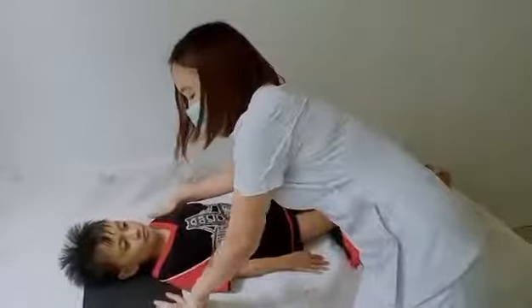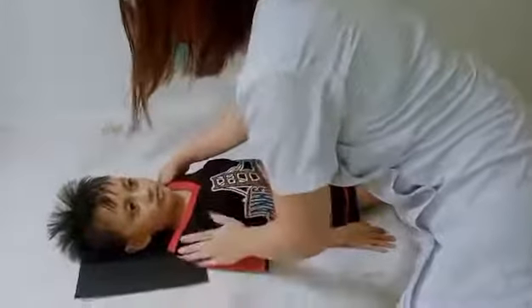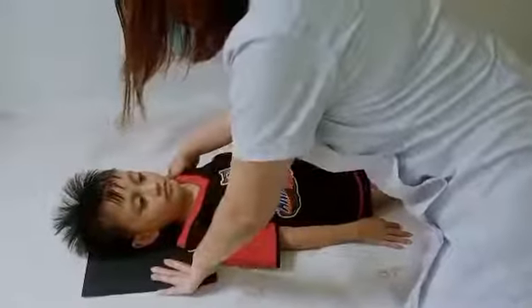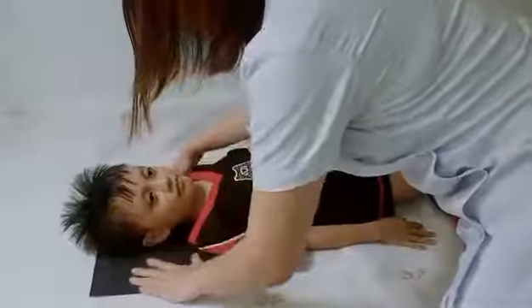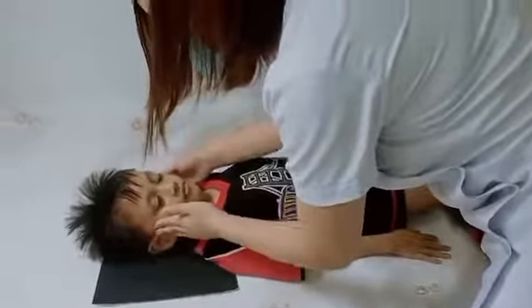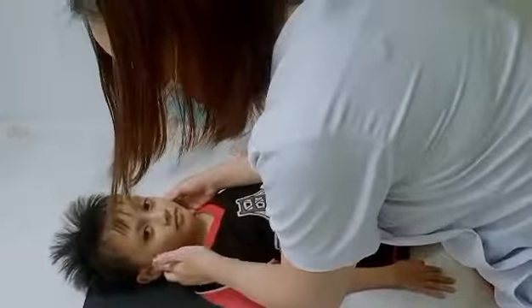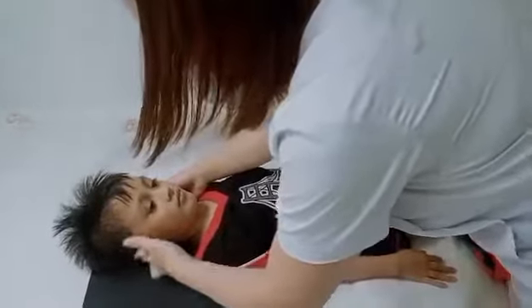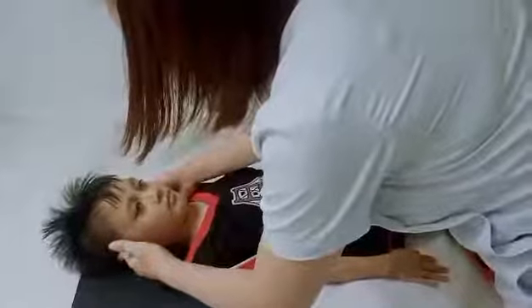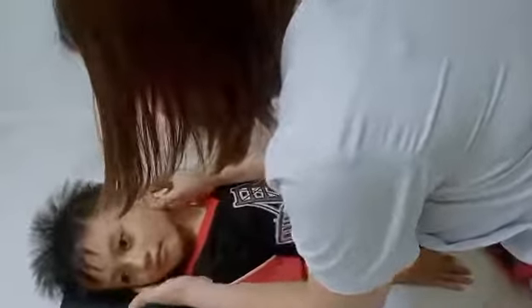Of part. So, imagine that the IR is placed inside the bucky tray. And then adjust the patient's head so that the midpoint of the IR is 1 inch or 2.5 centimeters lateral to the midline of the sagittal plane at the level of the EAM, or external auditory meatus. And then rotate the head 45 to 60 degrees away from the side being examined.